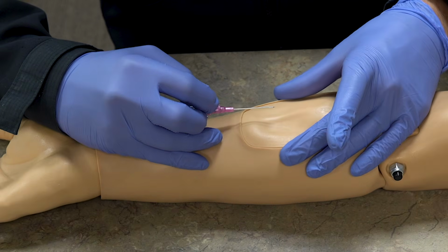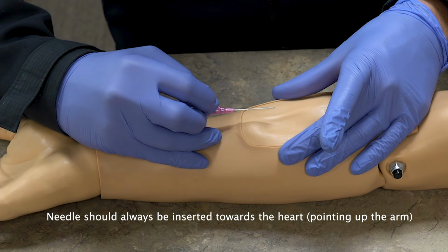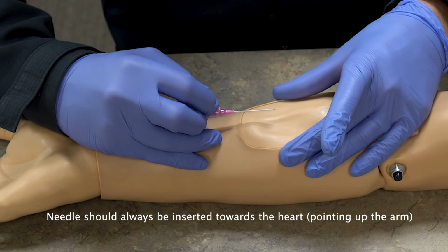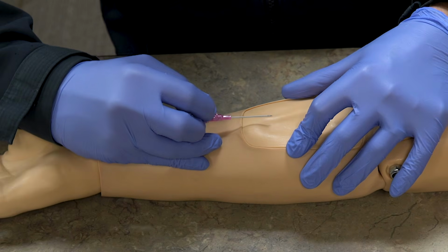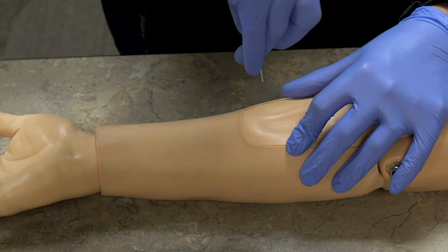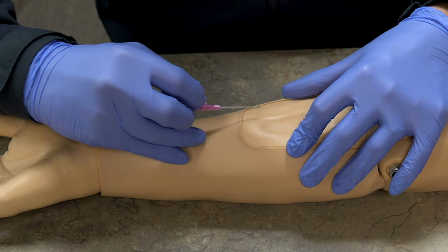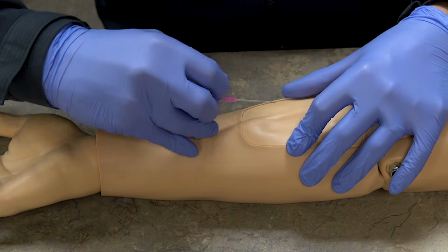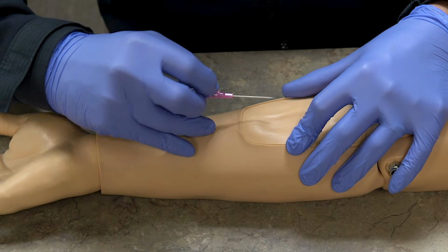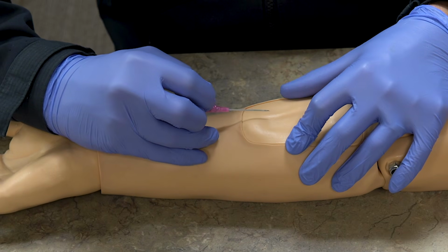So as I do that, I pull it to the side or pull it down. It's kind of personal preference and it kind of depends on the situation. This is gonna give you the best view. I'm gonna take this catheter, and you don't want an angle straight down. You want it to kind of follow where the vein is, and you don't wanna be going too deep. This is kind of a judgment call, and you'll learn when to go deeper and when to go shallower. This one's pretty shallow.